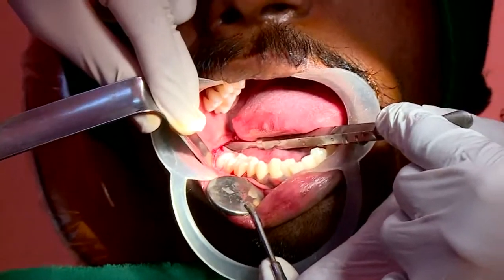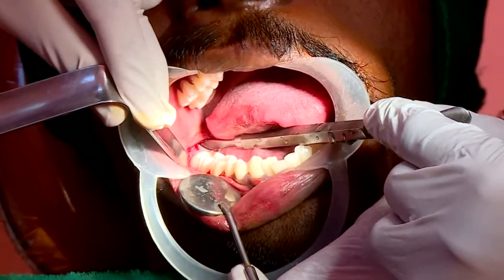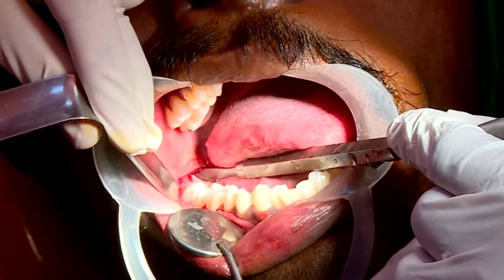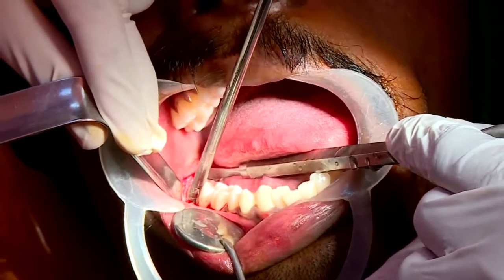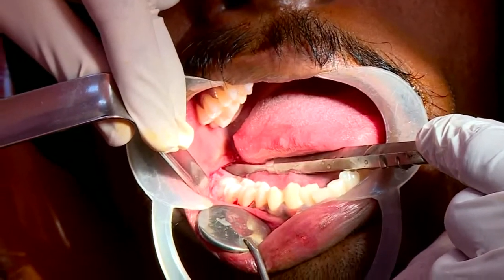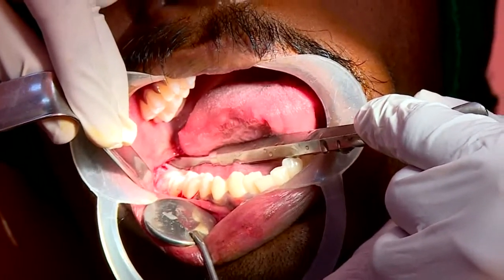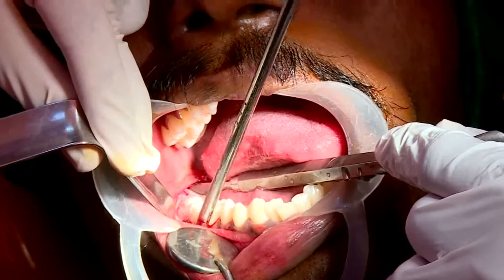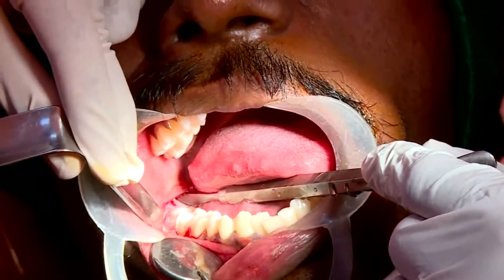You have to keep the handpiece parallel to the tooth. If it's a second molar, if it's a horizontal tooth, it should be kept parallel. So a good flap is very essential. See, there is good accessibility for the tooth, visibility is also good, and there is very little bleeding present.